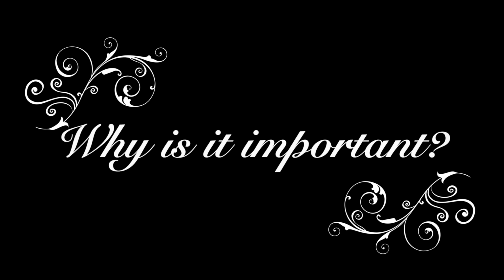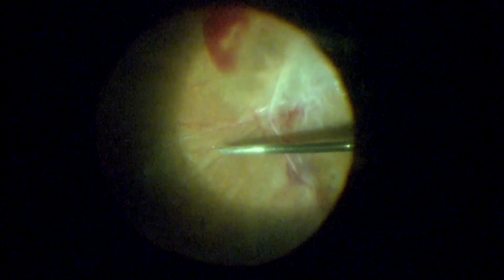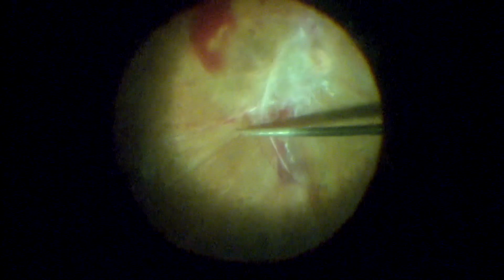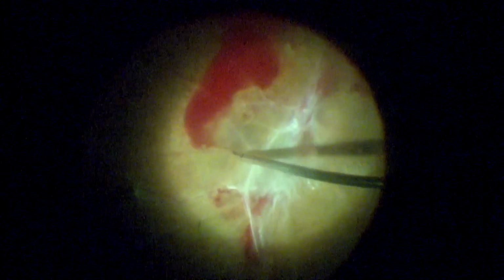Why is it so important to identify the secondary membranes? This video will show you how it becomes very easy to dissect the fibrovascular tissue by identifying this secondary membrane. Using a pick, I've identified the secondary membrane, and once you reach this cleavage plane, the membrane tends to dissect very much easily by just blunt dissection.